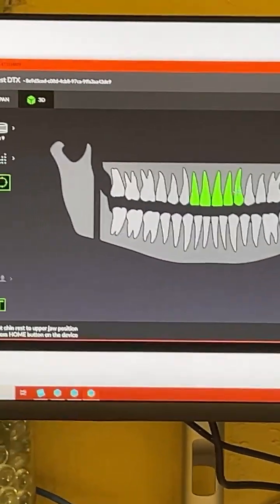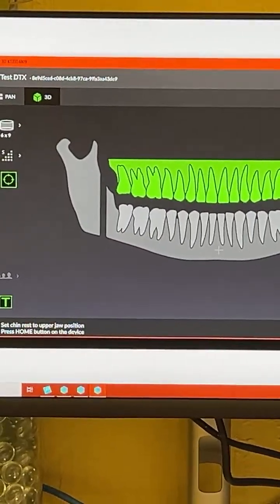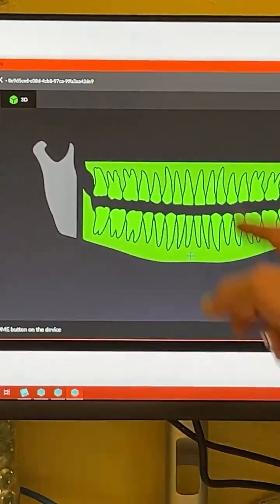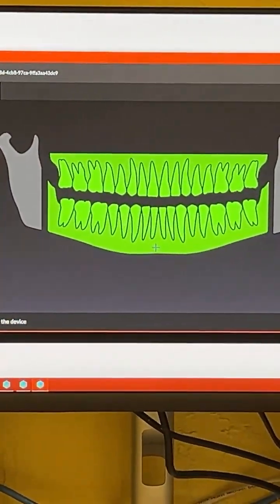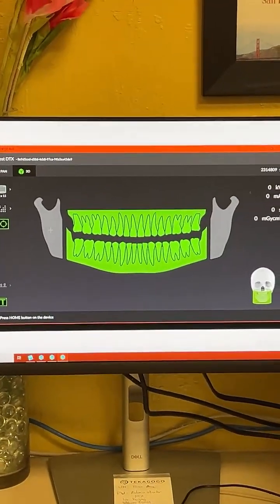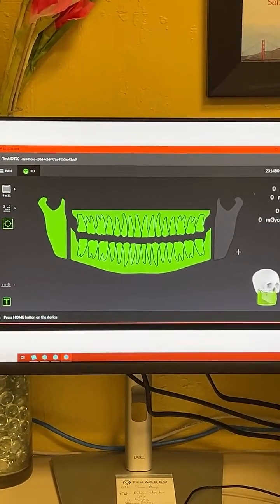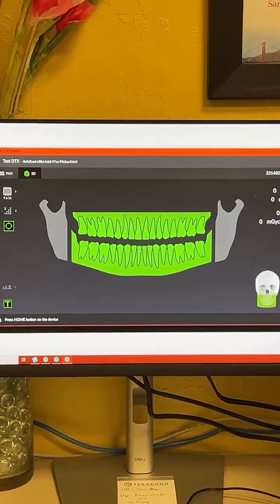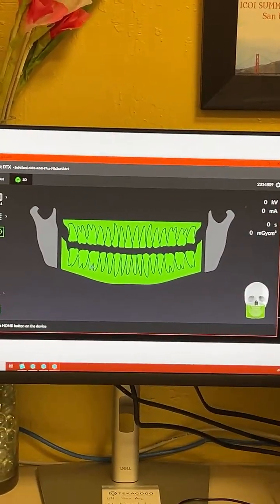Now you need to do a 6x9. You can just hit everything here. If you click down here in the bone, now you got upper and lower, and it knows that's got to be a 9x11. If I click 1 condyle, it's fine, but you won't get this one. Or you can say, I don't want that one. Does that make sense? Got it. Okay.